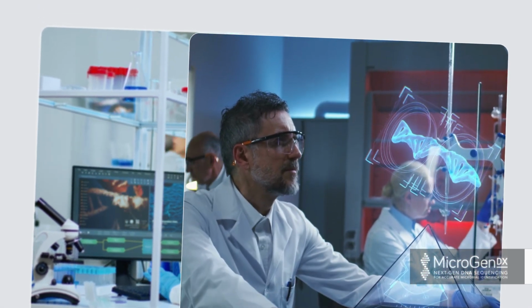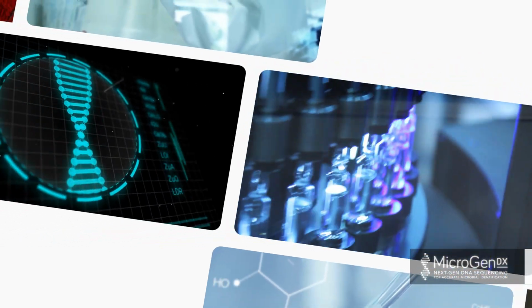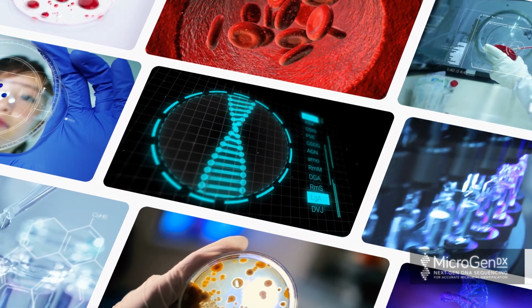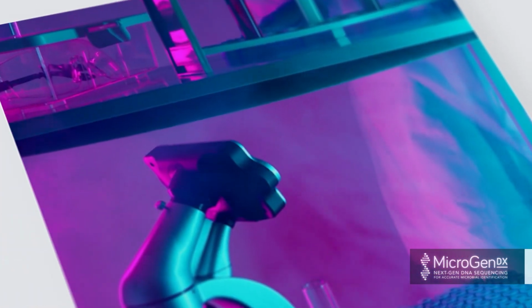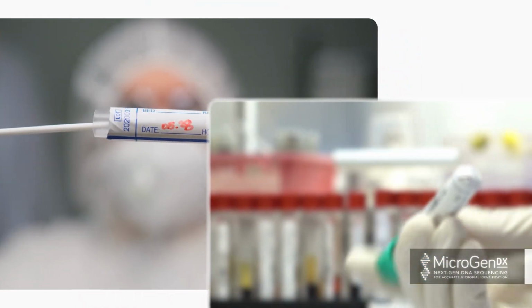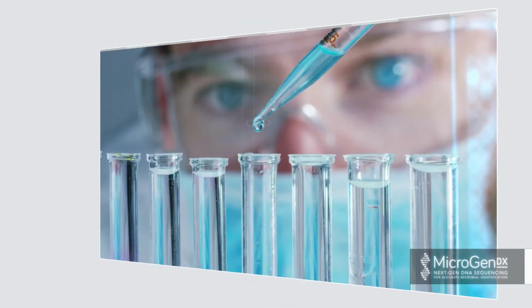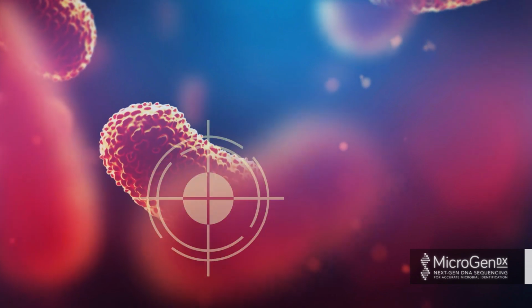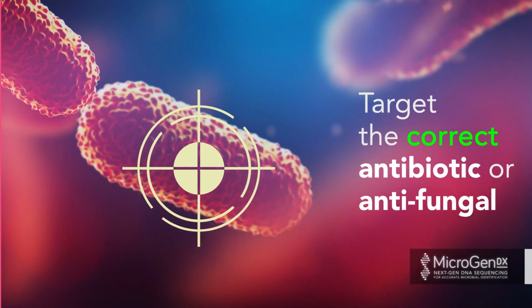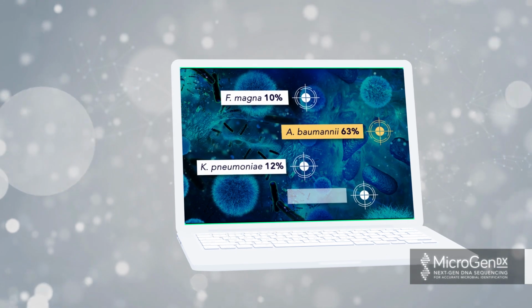Like a crime scene, we collect the DNA and then compare the DNA to a known library or database of the exact DNA sequence code. A match of the bacterial DNA from the sample to the database tells us what type of bacteria is in the sample. The DNA is the most precise method for detecting a microbe. Now that we know the type of bacteria, we can target the correct antibiotic or antifungal. Right bug, right drug. Using DNA to identify microbes is called molecular diagnostics.